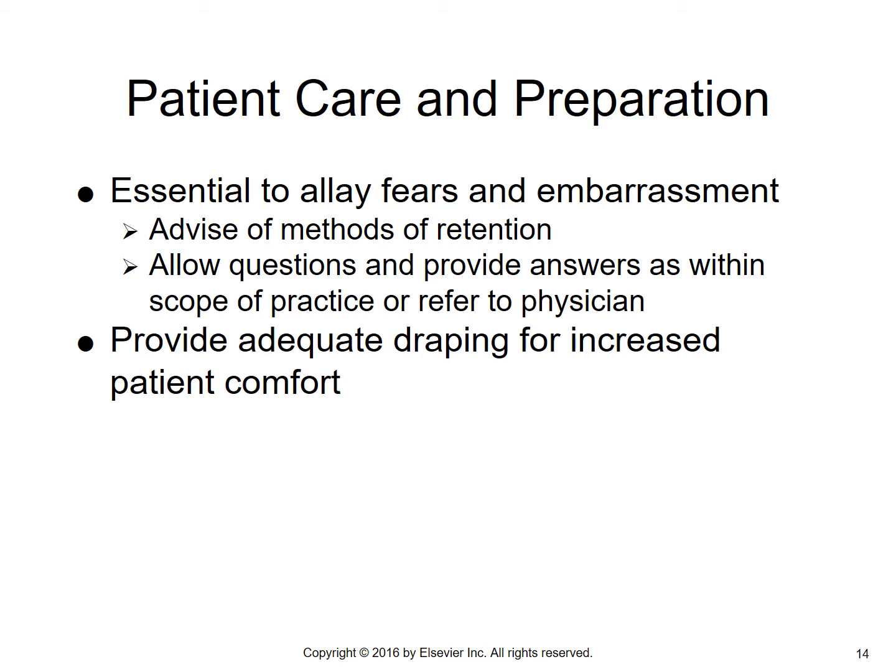They're going to be doing a lot of turning on the table. They're going to have an enema tip in. They're not going to have any underwear on, obviously. So you want to make sure that you're always trying to keep them covered as best that you can, as the tech, to maintain their modesty.